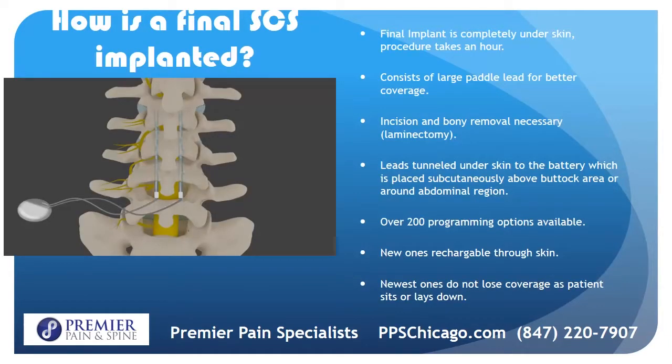Now, how is a final implant placed? Well, it takes about an hour. It's placed completely under the skin. It consists of a large paddle lead for better coverage. The latest ones have over 200 programming options available. The pain doctor or the neurosurgeon, whoever's doing it, makes an incision and then a small bony removal so the paddle lead can fit. And then the leads are tunneled underneath the skin to a battery which is placed subcutaneously either above the buttock area or around the abdominal regions. The latest ones are rechargeable through the skin, so they have a much longer lifespan. And it used to be that the old ones lost coverage when a person went from a laying to a standing position. That no longer occurs.